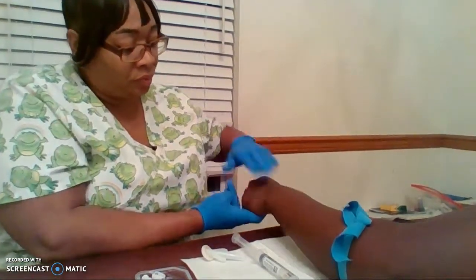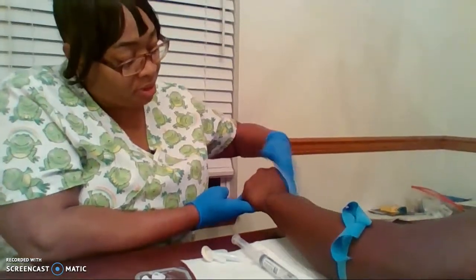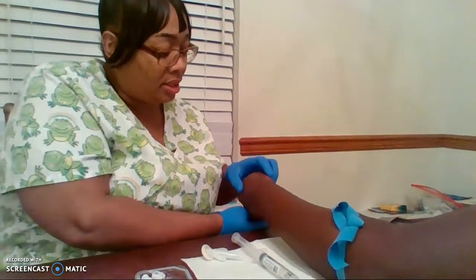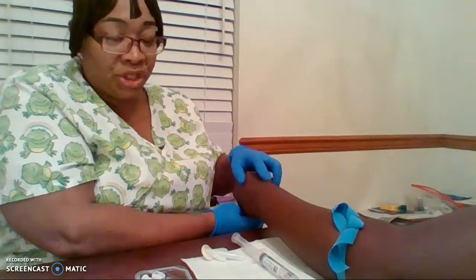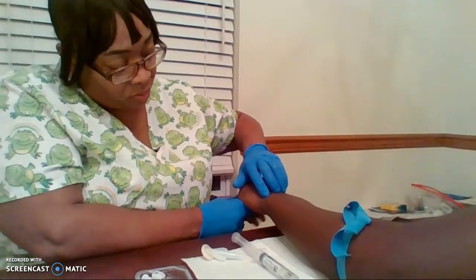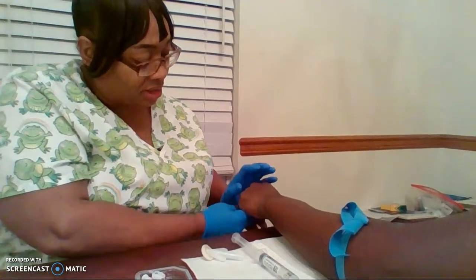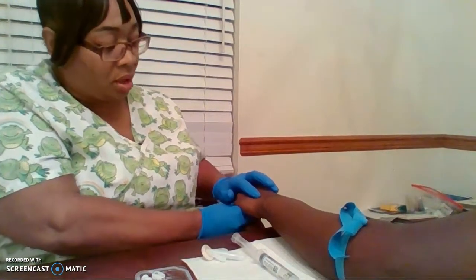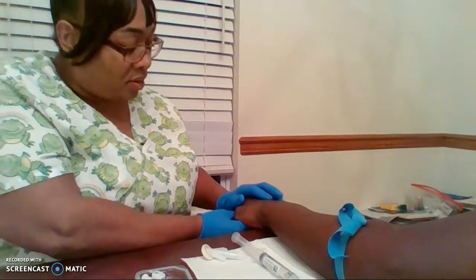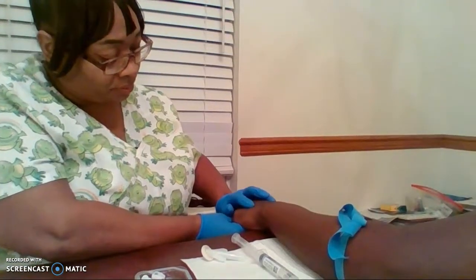All right. Looks like we may have a good one to choose from. Yes, they are pumping up really nicely. You can feel the sponginess of the veins. You can stop. All right, I'm going to go ahead and start this IV for time purposes. We don't want to run out of time for this instruction video.